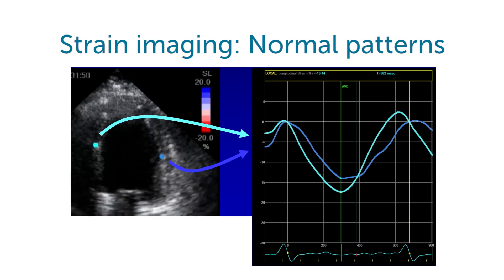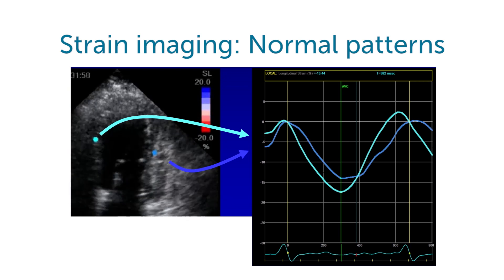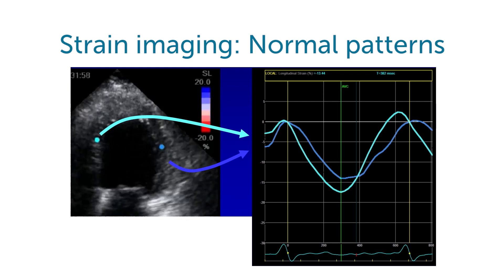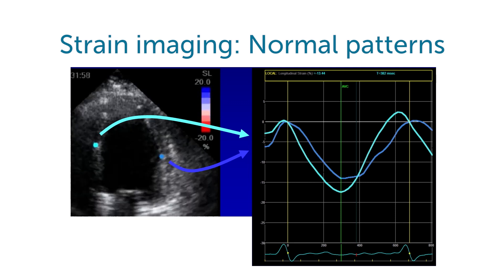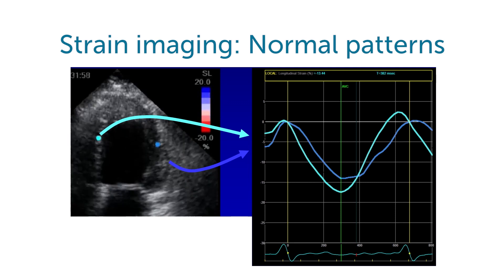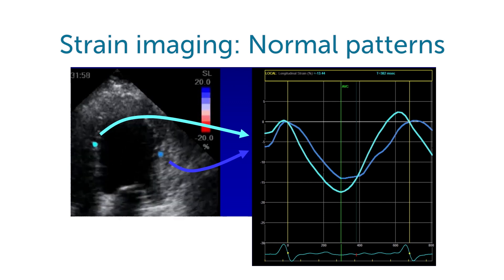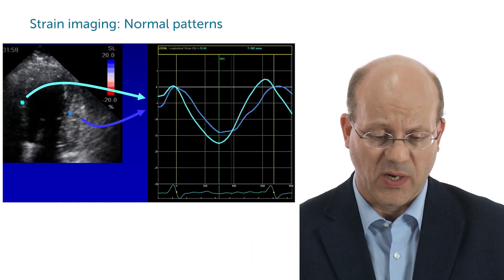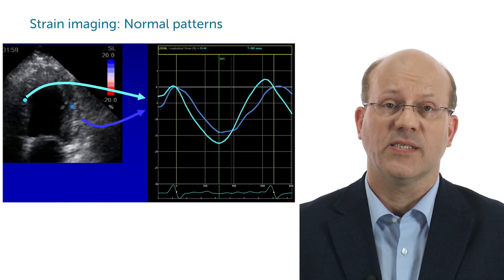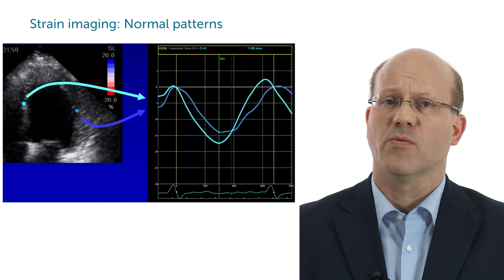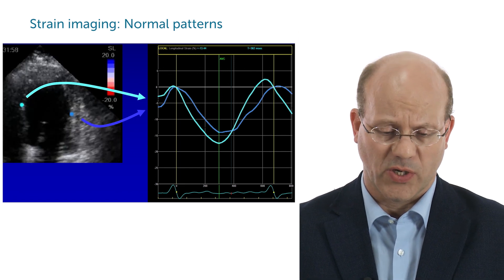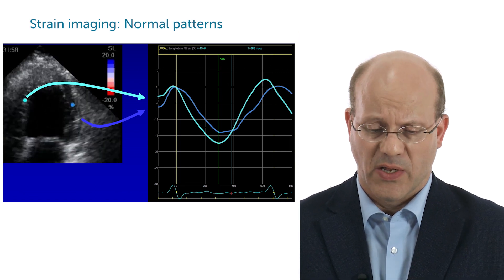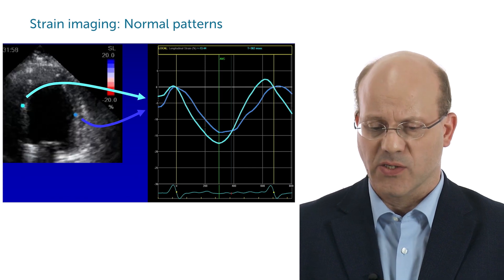So what can we do? We can measure strain and do regional strain assessment. I show you here the analysis as a comparison between a sample volume in the septum and a sample volume in this abnormally moving lateral wall. And when you look at the strain curves, you can clearly see that both curves are completely normal. They show systolic shortening, they are synchronous, and there's nothing abnormal to be detected.